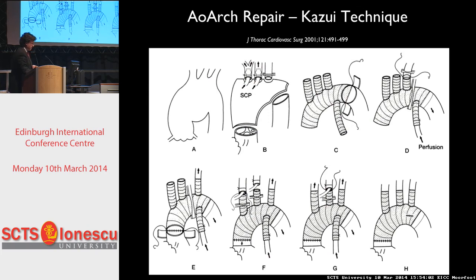I think this talk wouldn't have been complete without mentioning the landmark work of Kazui. I think he's the one who most likely popularized the sidearms, and you can see here the total arch replacement with sequential clamping and antegrade cerebral perfusion, which in his paper he thinks was a major contributor to his improved morbidity and mortality.